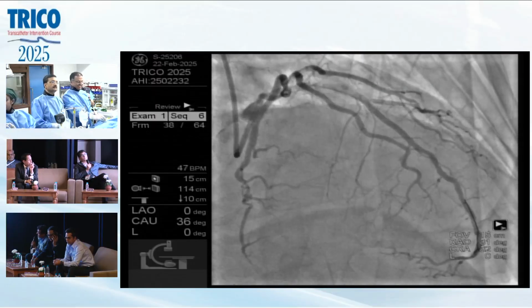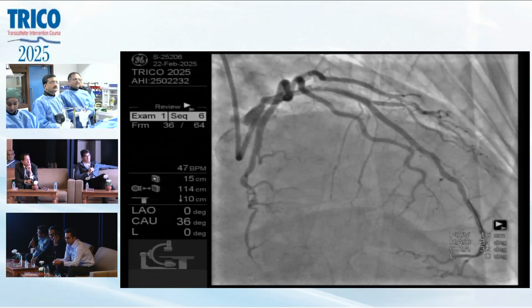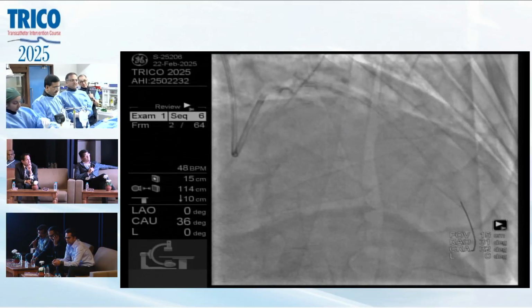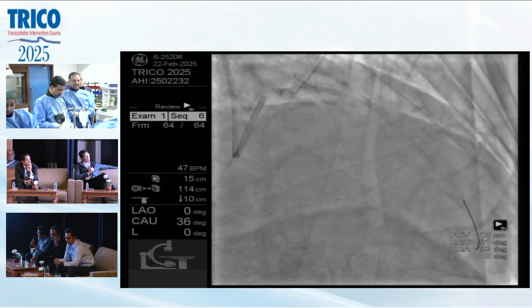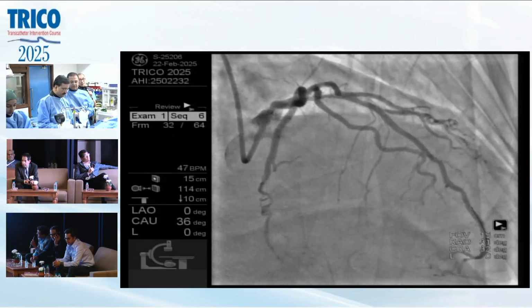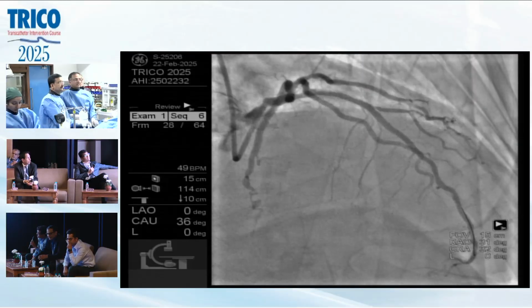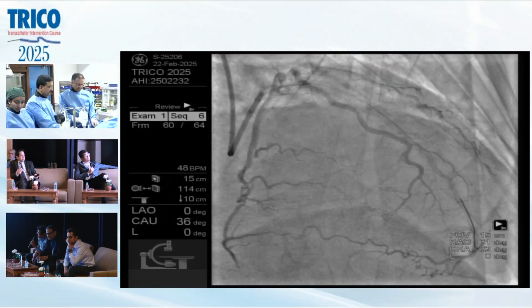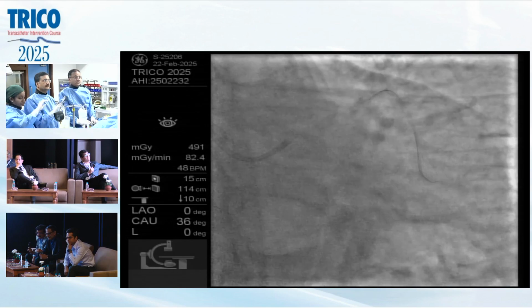Samir sir, if you look at the well expanded stent, we're going to go with the 3.0 size as per the OCT. Are you going to nail the ostium, sir? Samir sir, the caudal view shows the proximal size is about 4, with ostial plaque. 4, I think.